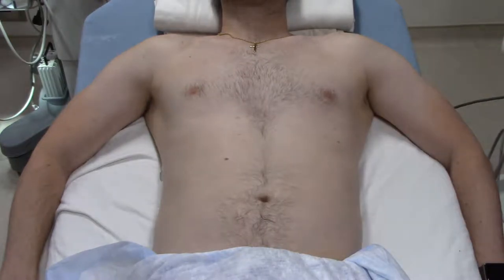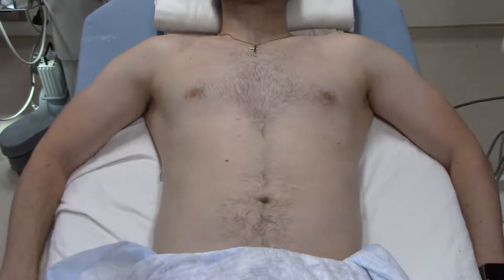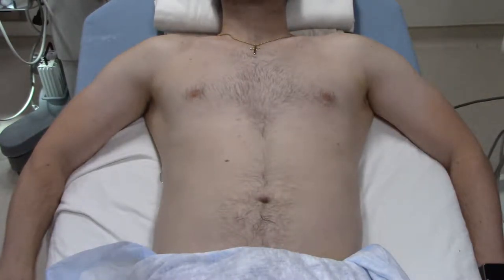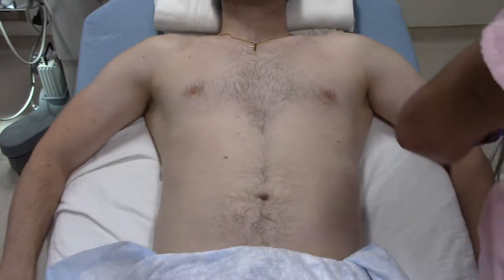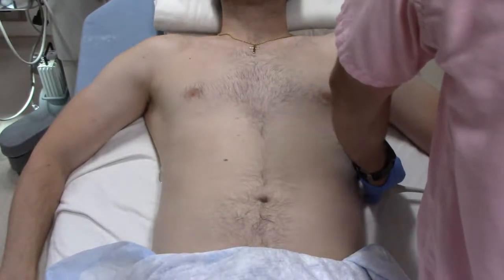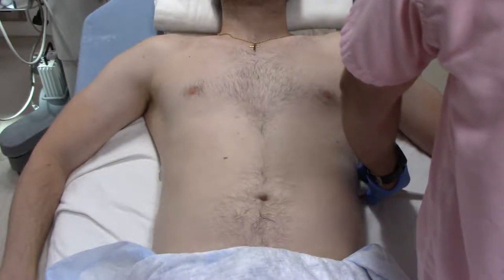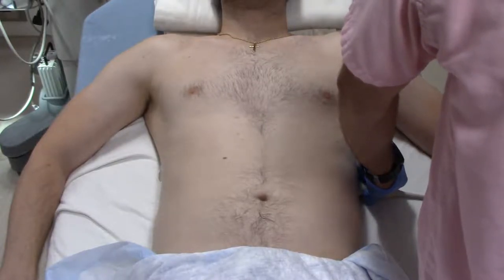Moving over to our left upper quadrant, make sure that we're labeling. We're going to keep the indicator towards the patient's head. We're going to find our splenorenal space. The spleen is a little bit more posterior, so coming back to the posterior axillary line.